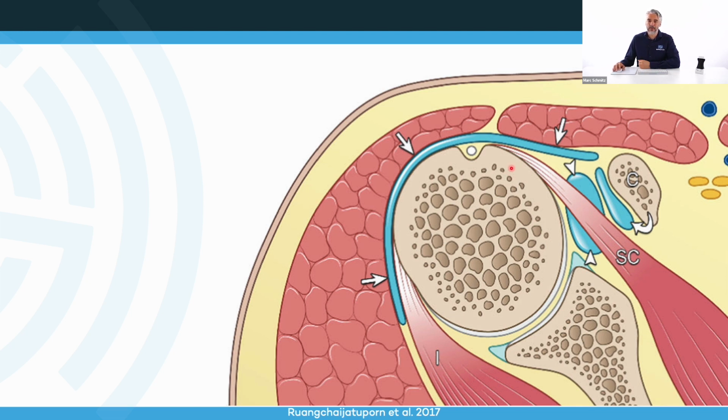Here you can see an overview of the bursas. So this is from an eagle-eye view. You can see that this is the humeral head with the subscapularis tendon and musculotendinous junction. We can see the outlet between humerus and coracoid process, so the coracohumeral outlet. And in this area, we can find 3 bursas, which is the subacromial bursa, subdeltoid bursa, subcoracoidal bursa, and then we have the subscapularis bursa. So this you check dynamically, functionally in this coracoid process region.